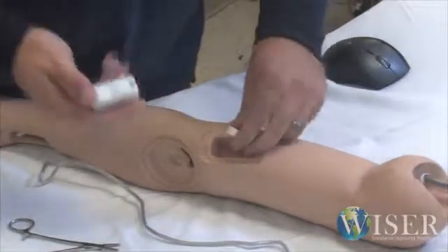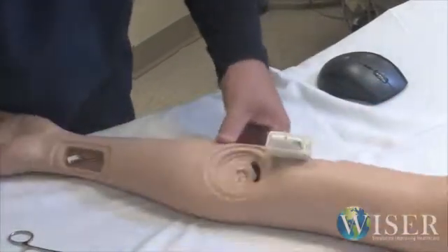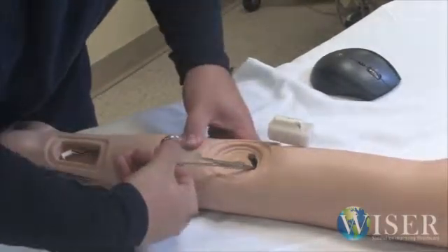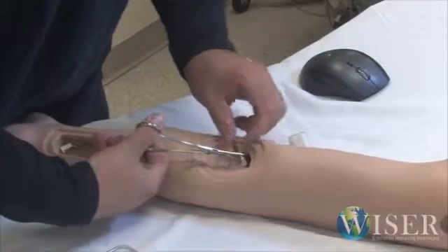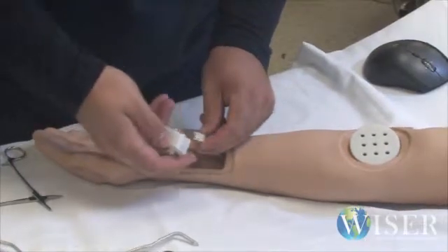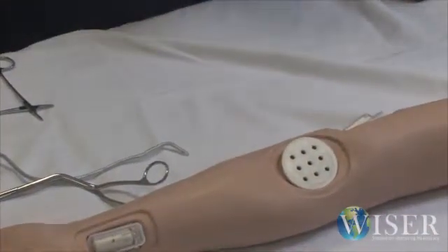And once it's through, I'd make it a point to connect so it doesn't fall back down to the arm. And you can move on to your next. I see it there. And this comes through. And be careful because these are delicate. Okay, then connect your speaker. And then the last one, luckily came right through. Not always the case. Sometimes you get lucky. Reconnect that. And then we're ready to put our skins back on.